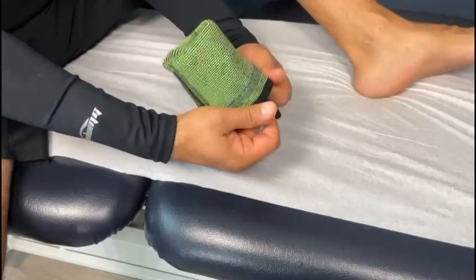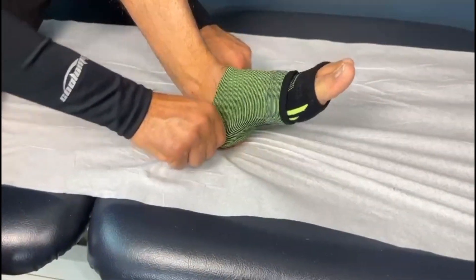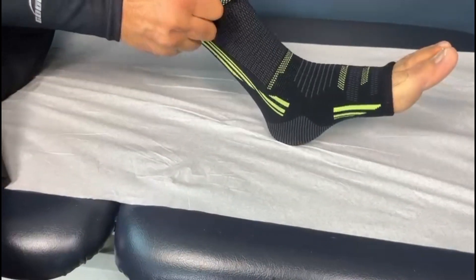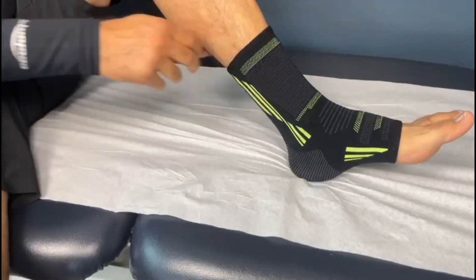To properly put on a brace, follow these steps. Begin by sliding the elastic ankle foot support onto your foot like a sock. Ensure maximum comfort by making sure the foot support fits snugly around your ankle.